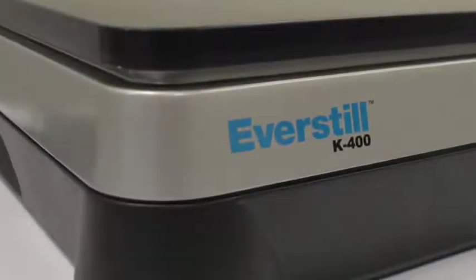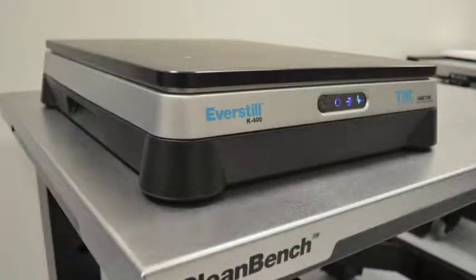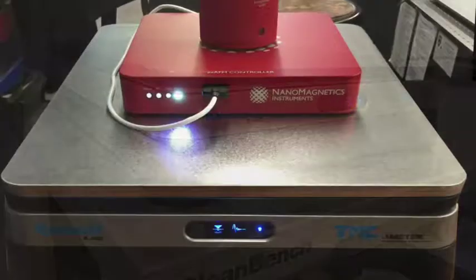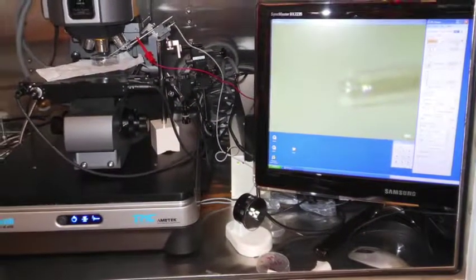EverStill is a new technology developed by TMC — the next generation in active inertial vibration cancellation. The K400 uses a patented active vibration cancellation technology designed to fit a number of different types of small yet sensitive precision instruments.